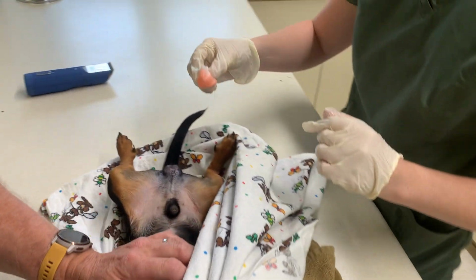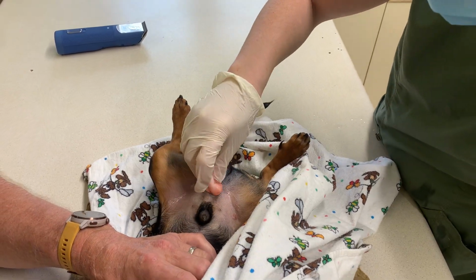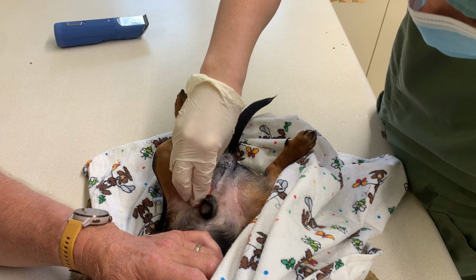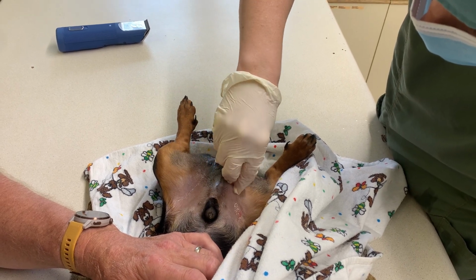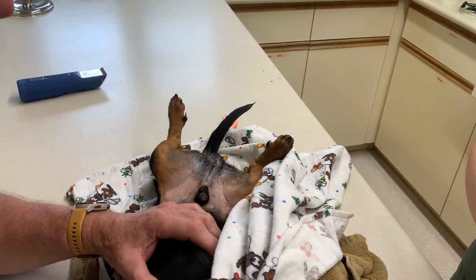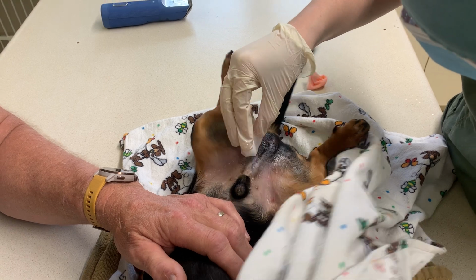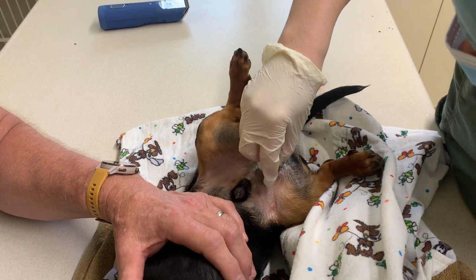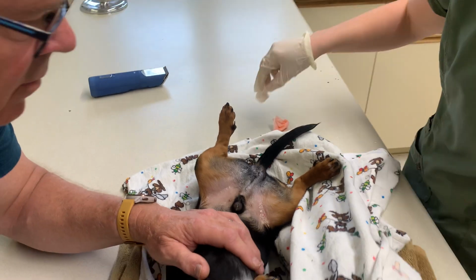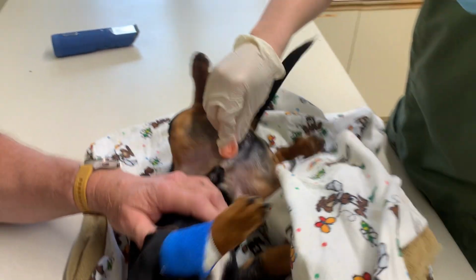And we have our incision site. So the incision site is going to be down here. So I'm going to take this. Easy, but it's okay. And I'm going to work out, turning as I go, as you can see there. And then we need to do one with water. Just like this. We're doing this one with water. Just like this. And then the chlorhexidine one, and this chlorhexidine one has to be done with a little bit more scrubbing action. We're going to go in here.